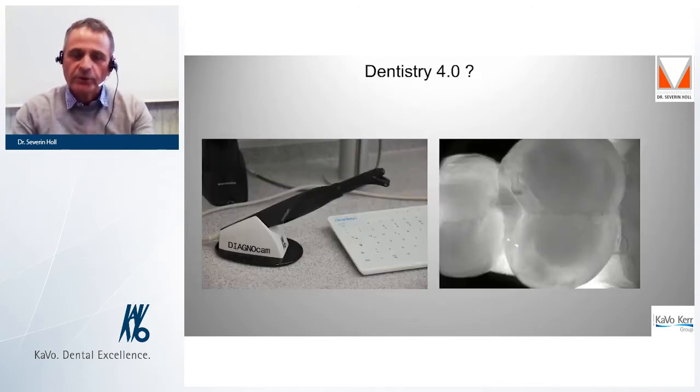Or consider the possibility of radiation-free caries diagnosis using the diagnocam from KaVo. With a wavelength close to the infrared spectrum, caries can be detected and documented. On the right side, you see a significant enamel caries in the distal region.